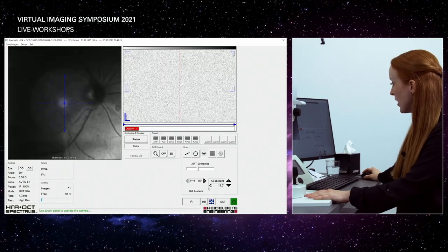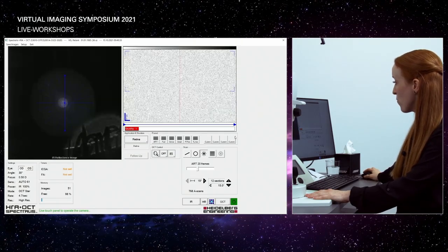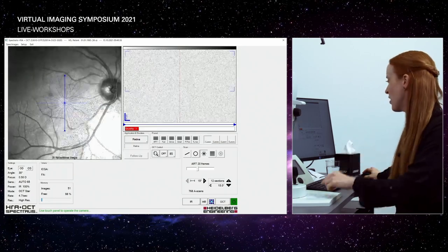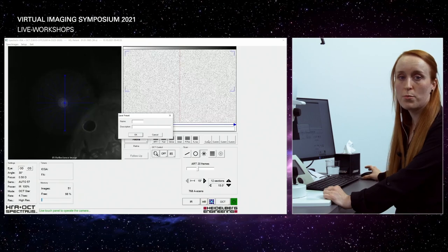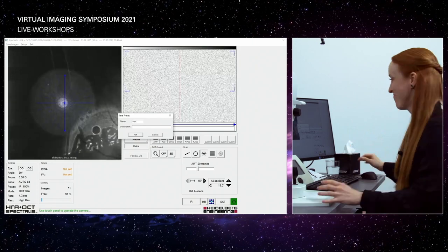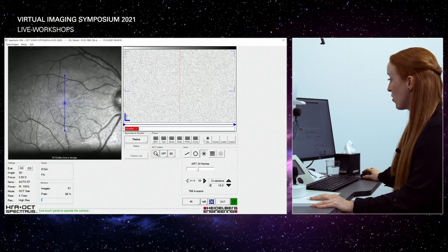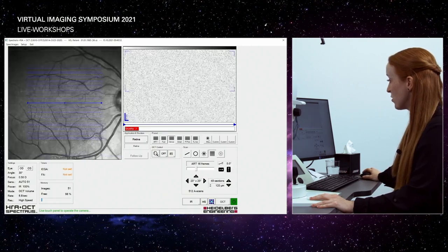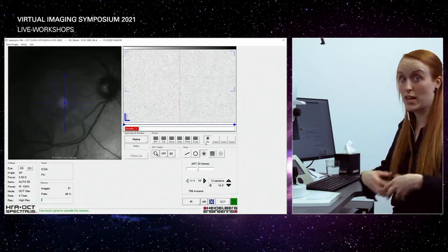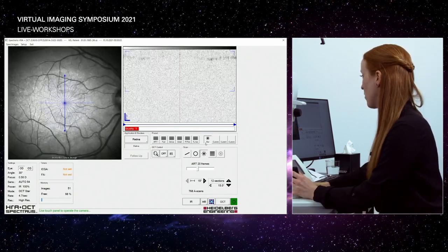And if I have collected all this information on my scan pattern, I have those four free custom buttons right here. If I hold down my left mouse button right here, a dialogue comes up and I'll give a name to this scan, maybe just name it Star. And I'll save this scan right here. So for now, we are able to use the star scan like our dense scan, okay? If you now click on that button, this pattern is saved and you can use it again and again. So let's do this star pattern right now, okay?